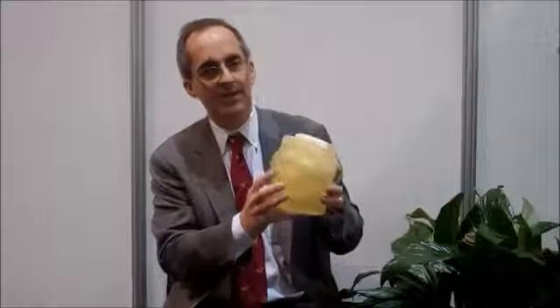There's really no other way that we can do this, and no other way we can appreciate these 3D volumes other than 3D printing. Her point in time today is going to be different than her point in time as she continues to heal and she continues to get better in terms of her functionality of her face. Also very importantly is we're going to start studying the science of what these tissue volumes mean.